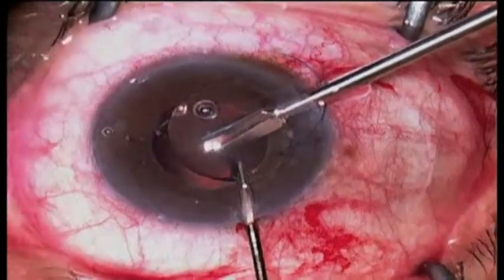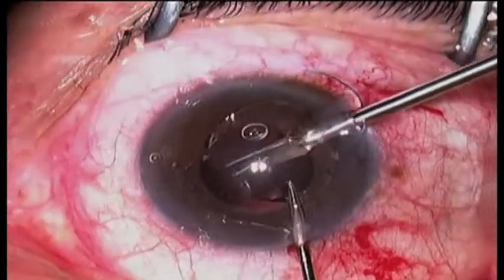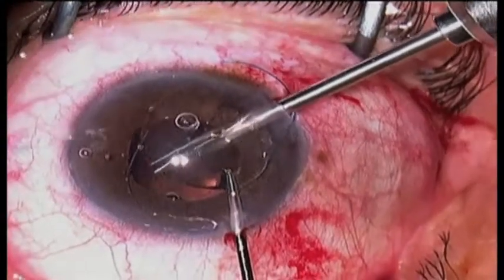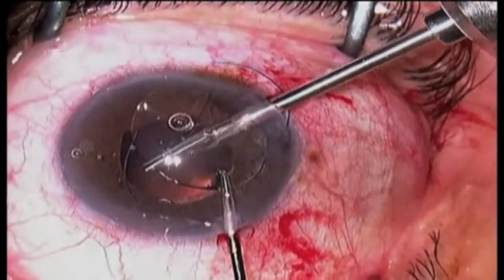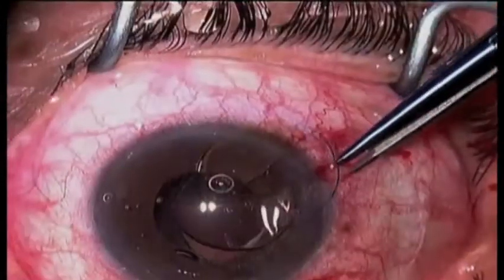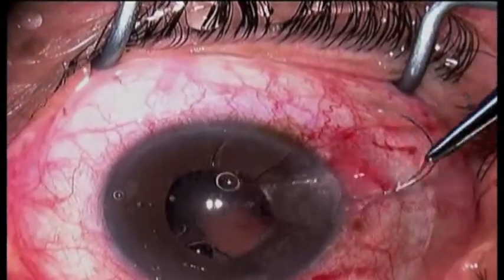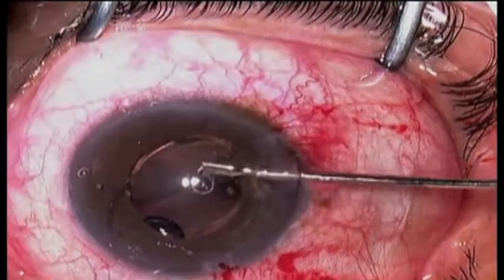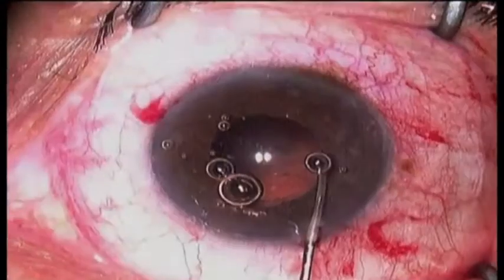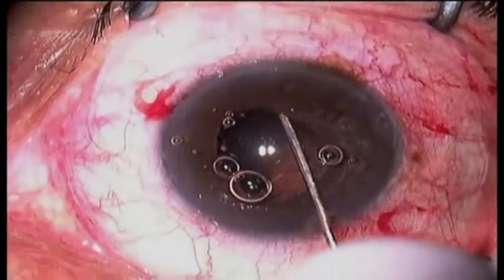In some cases you need to rotate the lens 180 degrees and cut from the other side, but in this case I was able to get through the lens completely all the way across in one cut. The pieces are then taken out one half at a time through a three millimeter incision without difficulty.